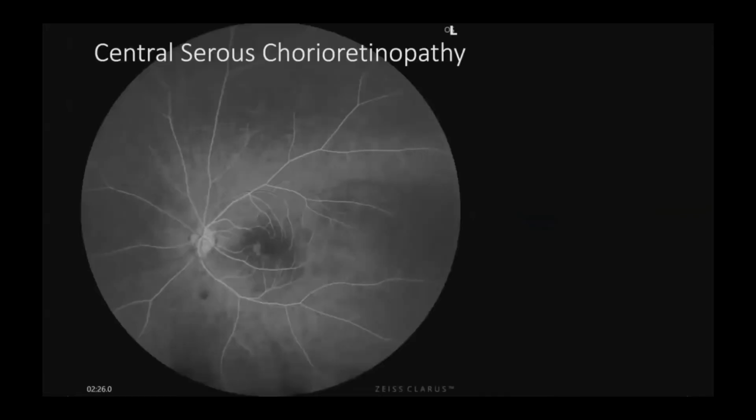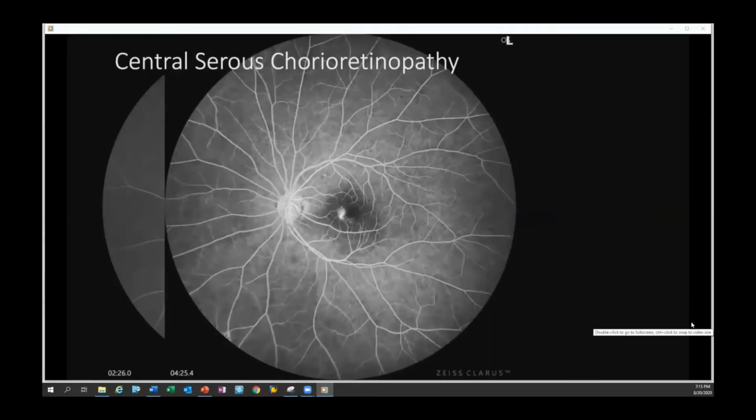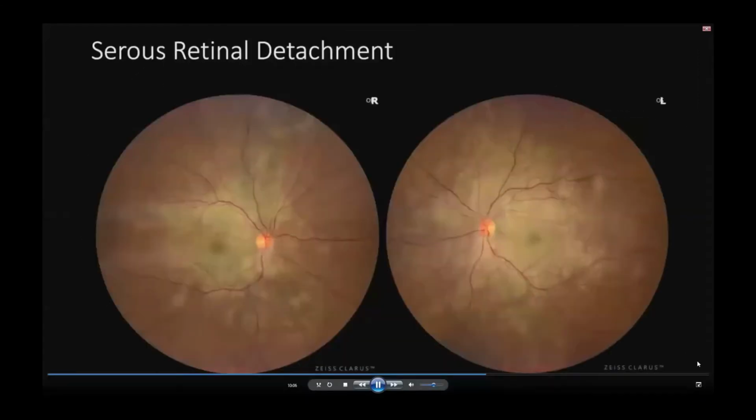Pooling occurs as dye accumulates within a cavity. And so the most common one we'll see is in retinal detachments due to central serous. And the classic finding is of a smokestack area of leakage that pools into the serous detachment. But it occurs in other forms of serous detachment as well.